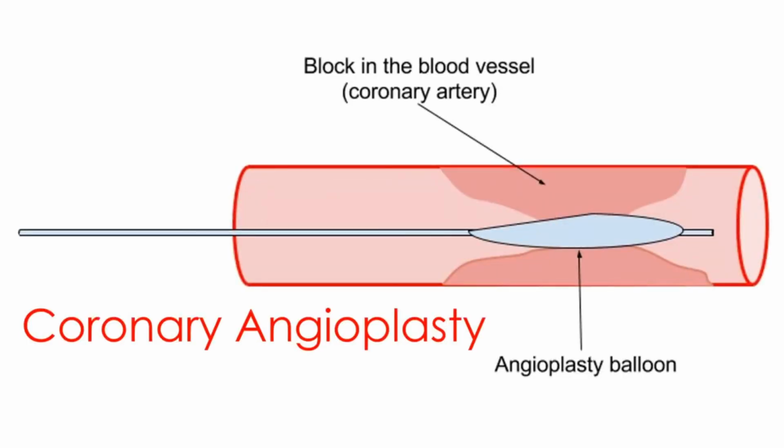Cooling of the body was maintained in the intensive care unit using the machine for 24 hours to improve brain recovery. Those patients with a suspected block in the blood vessel of the heart were transferred for a test known as coronary angiography, X-ray imaging of the heart after injection of medications. This was in view of mechanical removal of the block using a balloon-tip tube known as coronary angioplasty.